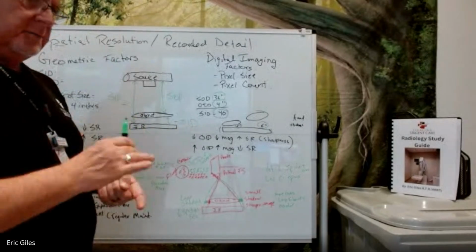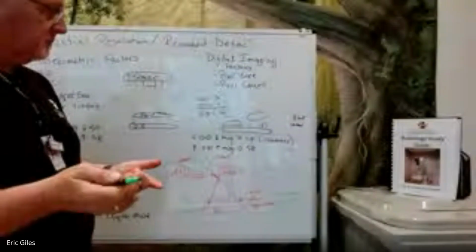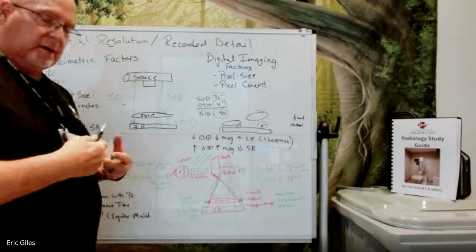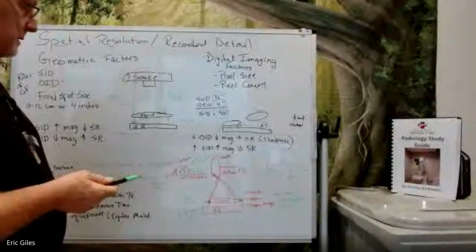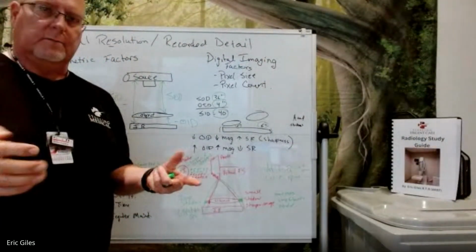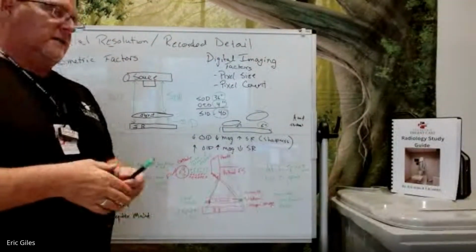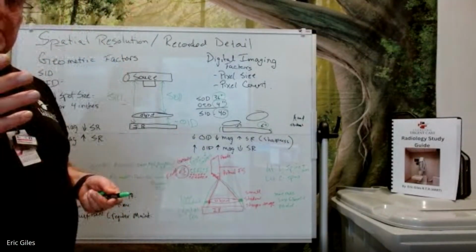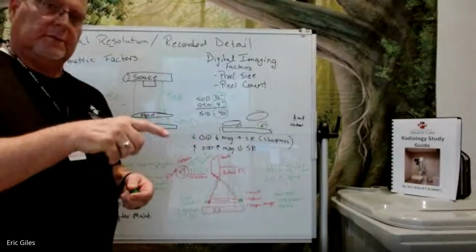Okay, so small focal spot, you're going to have less X-rays, right? Less produced X-rays. With the large filament, we're going to have more electrons go across, translating into more X-ray photons. The good rule of thumb is anything under 10 centimeters or approximately 4 inches, you can use a small focal spot. Say you're doing a hand, wrist, finger, toe, foot. They're all under 4 inches or 10 centimeters.